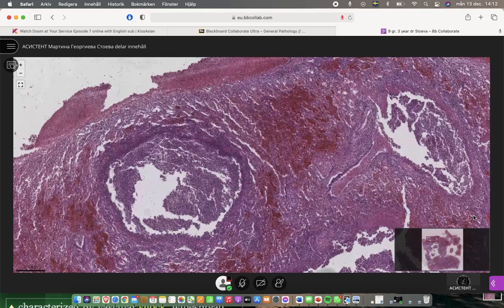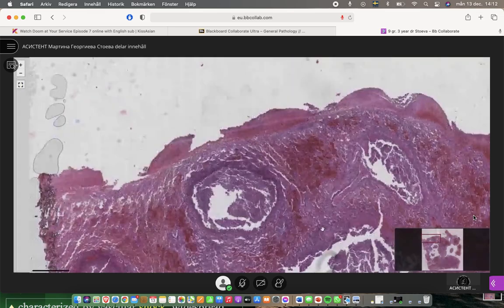No, don't classify the pneumonia this way in this case, as typical or atypical. Just say that this is a bronchopneumonia with formation of abscesses, because you can be asked about this classification of pneumonias into bronchopneumonia and lobar pneumonia. Lobar pneumonia will be the next one that we are going to discuss in a few minutes. So here it is bronchopneumonia, because as we saw, we have both inflammation of the bronchioles and the lung parenchyma.